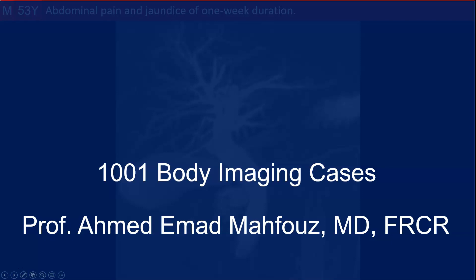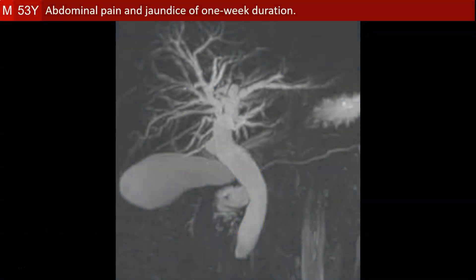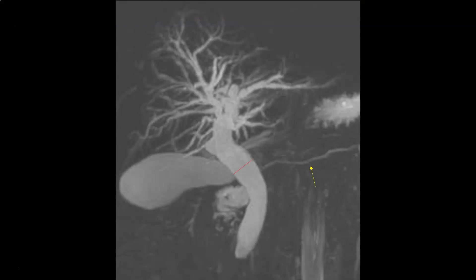Welcome to the body imaging cases. This is a 53-year-old male with abdominal pain and jaundice of one week duration. The MRCP — that's to say the magnetic resonance cholangiopancreatography — shows marked dilatation of the common bile duct down to its lowermost end, and also the intrahepatic bile ducts and the gallbladder, but normal caliber of the pancreatic duct.